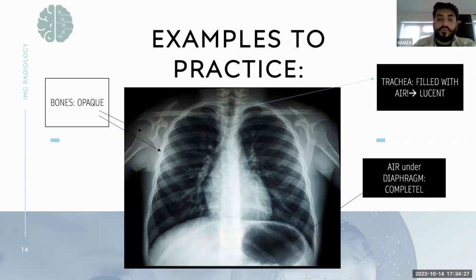And as Dr. Ju said, a bright white will usually represent metal. So those patients coming in with devices, intracardiac devices, or even, for example, if they've had metallic implants put in, they will present as very, very bright white. So just get used to these basic principles for now, and the next presentation will be talking a little bit about what they actually mean when it comes to atypical presentation. And we'll move to the next slide.